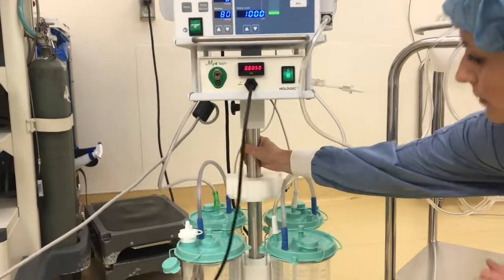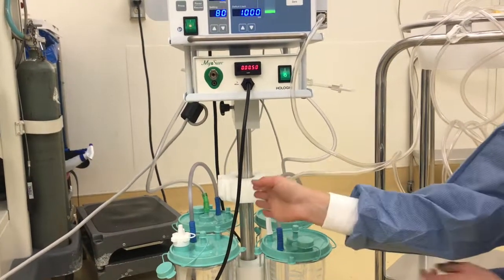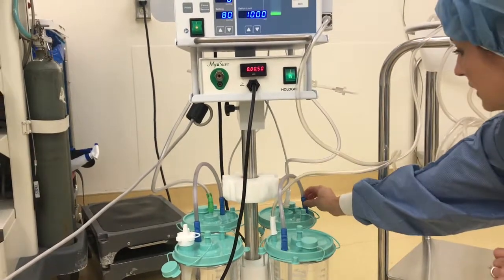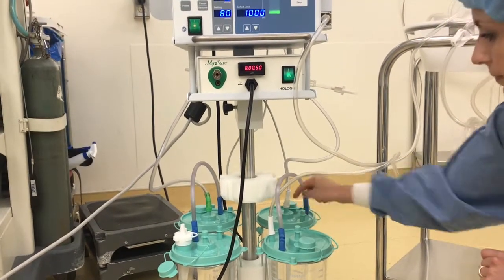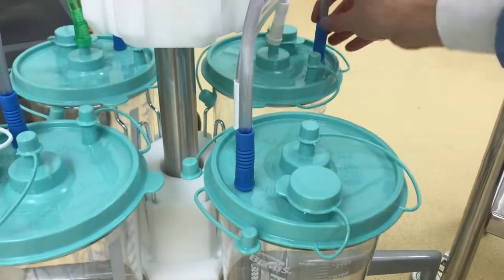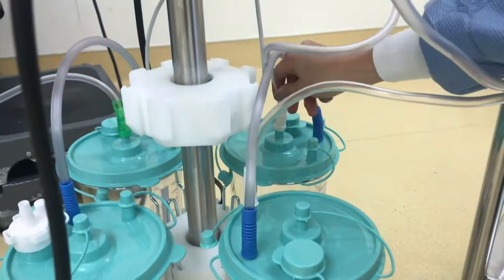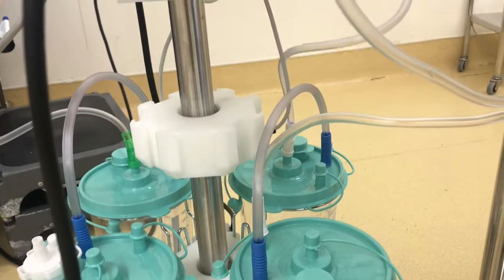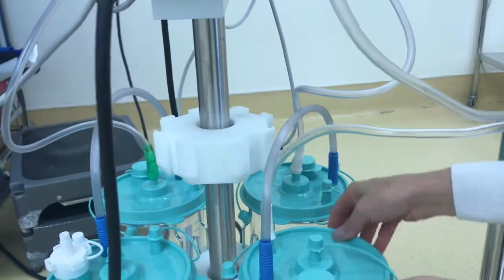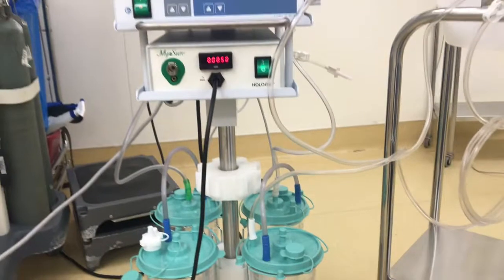On the bottom here, we have four canisters. The right side is fluid management only. The left side, you only need to worry about if you're doing a polypectomy. Make sure these two pieces of tubing are tandem to tandem. The middle and the back — the vacuum port — will be connected to the suction in the back of the top of the machine. Make sure these are secured and tight. And then the white goes up to under the butt drape.